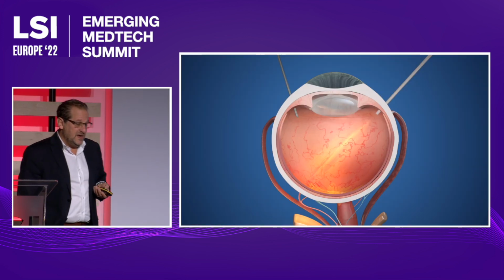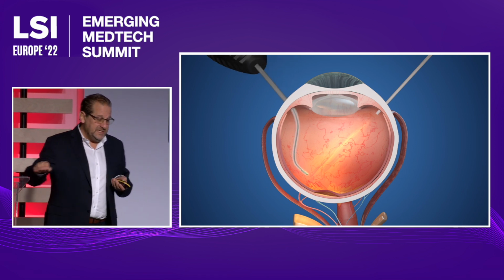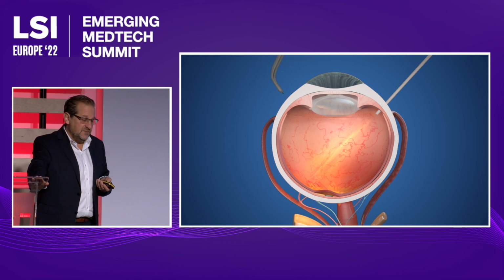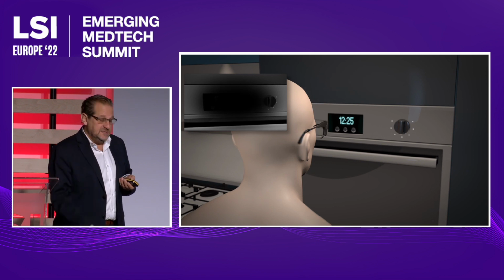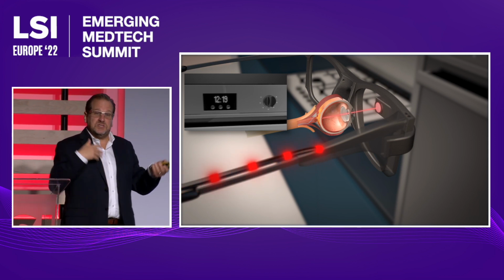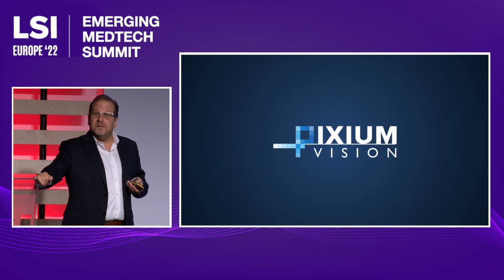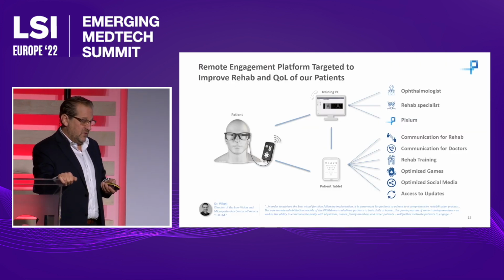You can see the retina there. Those are the cells that no longer function, where we place our implant. We create a small incision. The surgeon will inject the implant in the subretinal space. They will apply gas or oil to reattach the retina. 4 weeks later, once the retina is healed, patient comes back, we put the glasses on, and then the rehabilitation process starts where they learn to use the system, and they can begin to perceive the images and letters and numbers, etc., that we create for them.